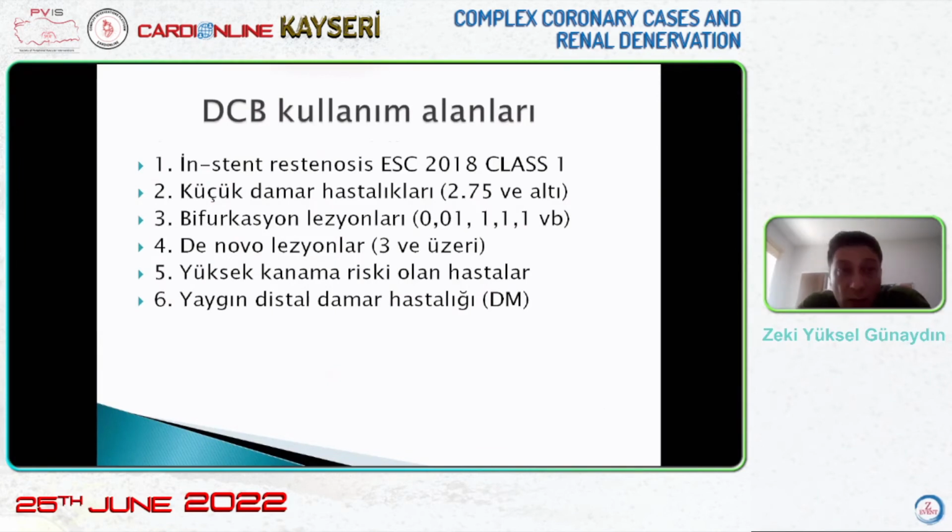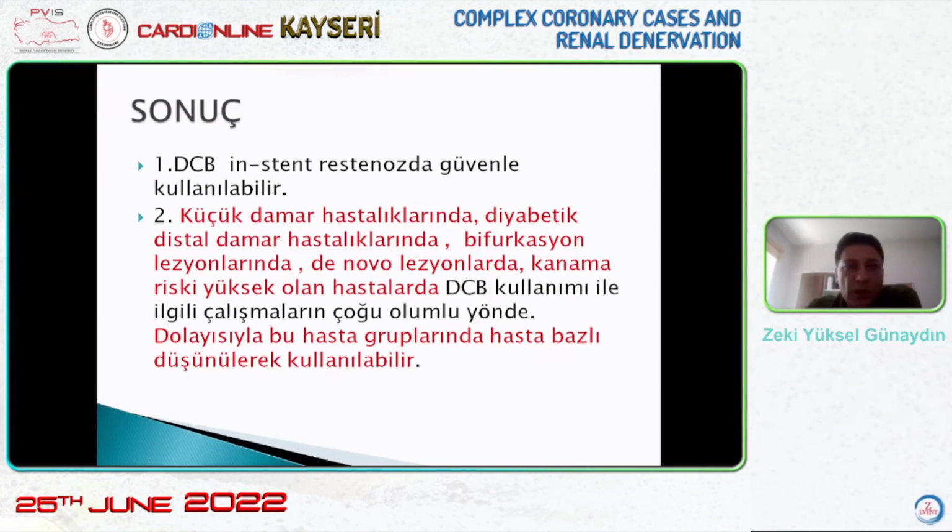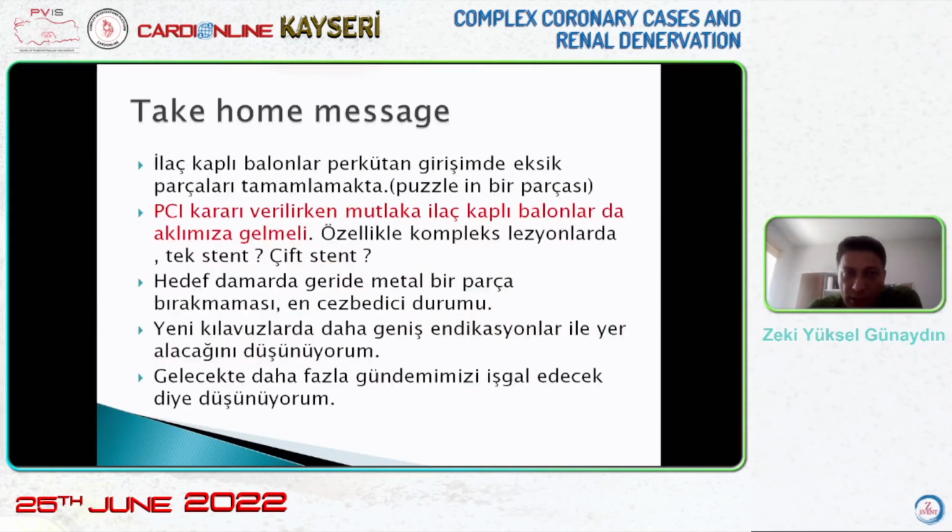As a result, what are the fields of use? In-stent restenosis. It can be used in bifurcation lesions. In de novo lesions, it is recommended, especially for patients who cannot use dual antiplatelet drugs for a long time. As a result, we can say that for these patient groups, we can make a plan specific to the patients, and drug-coated balloons are a part of the puzzle.